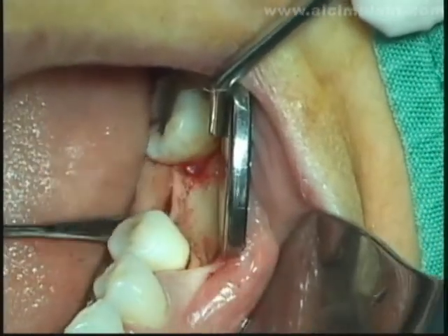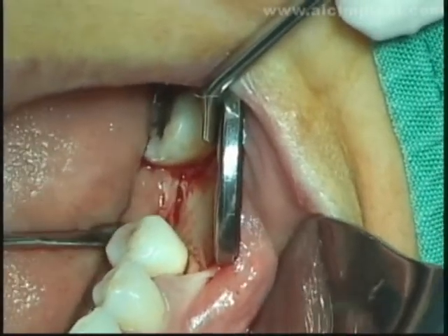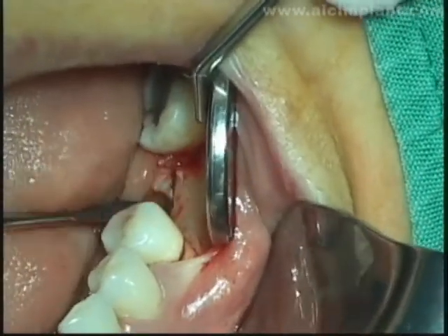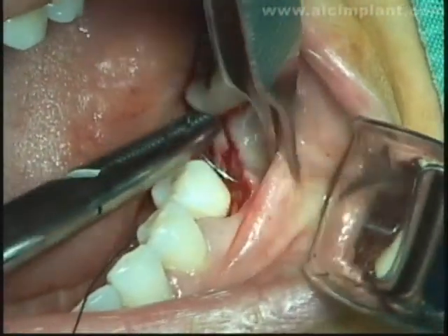Flap reflection is being done with a periosteal elevator. Hold the buccal side with a vestibule together and suture.